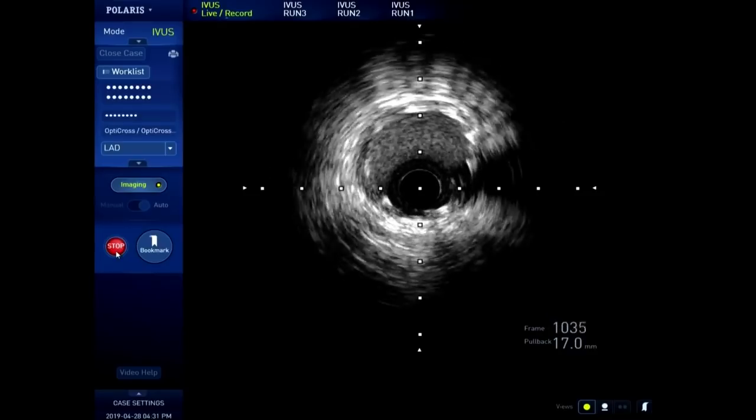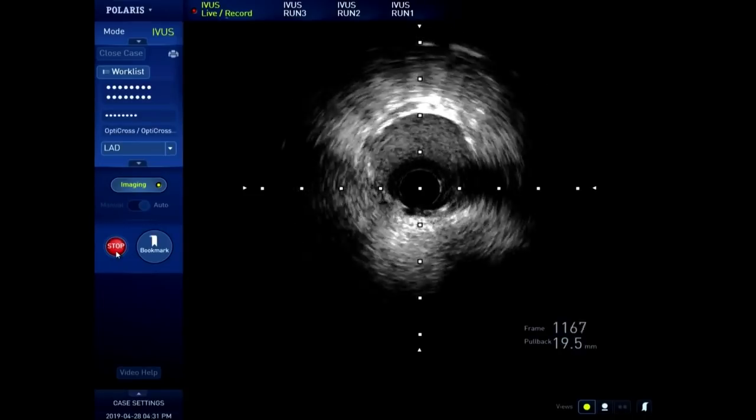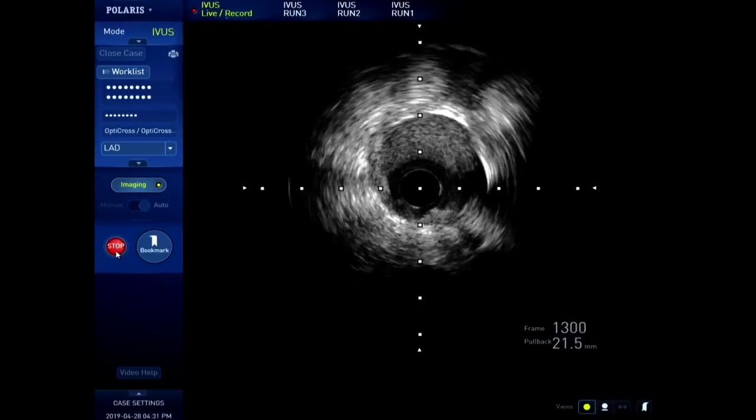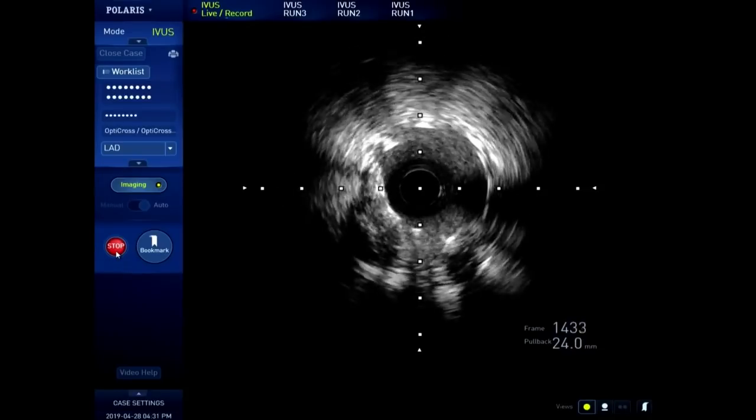Yeah, the right stent 3.5, the area is maybe more than 5 millimeters square. Exactly. Even angiographically quite small vessels, I think it is quite good. Okay, stent here, positioned at the ostium.